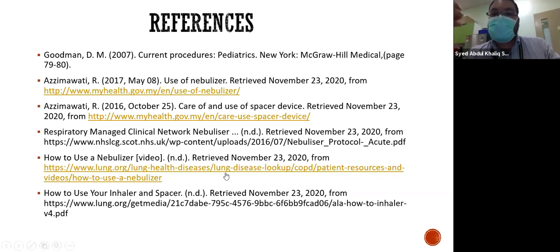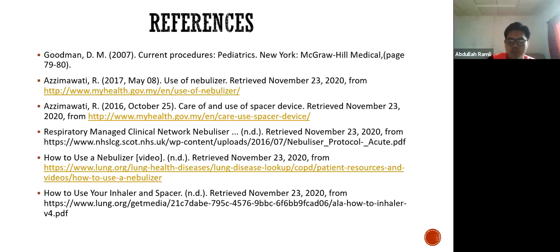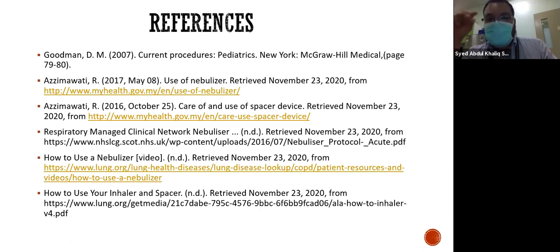The first one is the flow. For example, if we use a ventilator, the flow of air pushes the aerosol in. That's one. The second is the size of the particle, so this is important as well. For example, if you give a nebulizer and you set the flow low, like 4 liters per minute, the issue is that when the flow is low, the particle size from the nebulizer will be big. The smaller the particle, the farther it will go inside the lung. Big particles only go a short distance.